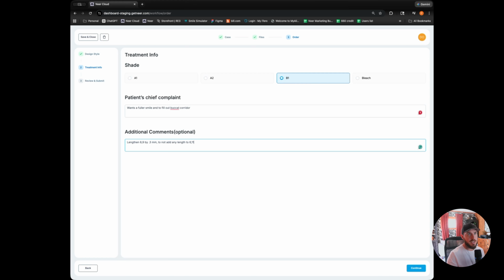Really, the more information here that you can give us, the better. So whether it's your smile design or what you know your patients want through a consult, the more information that you give our design team, the easier it is to design a smile right off the bat.